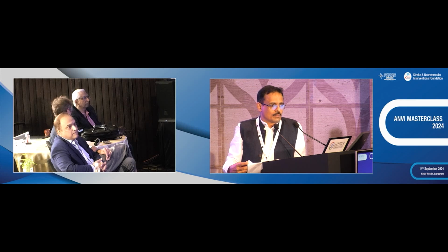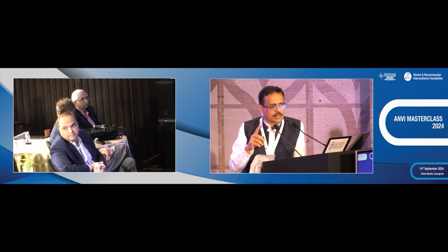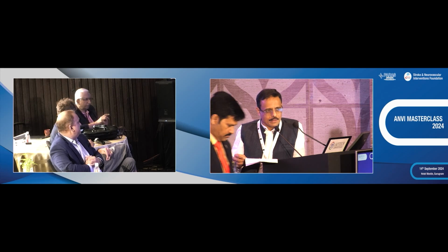We have tried few drug-eluting balloons in the same location in M1, and they have worked wonderfully in the acute case. Okay, that's a thought. Simple drug eluting first, all right, with a 1.5 mm balloon followed by another 2 mm balloon. Lovely. Okay. No drug eluting.